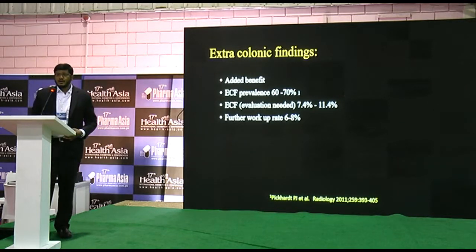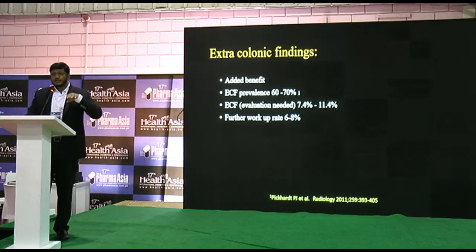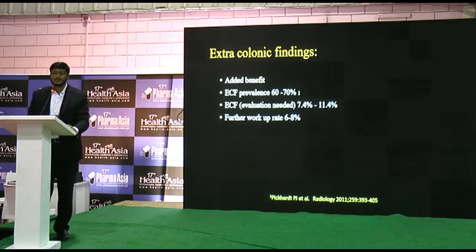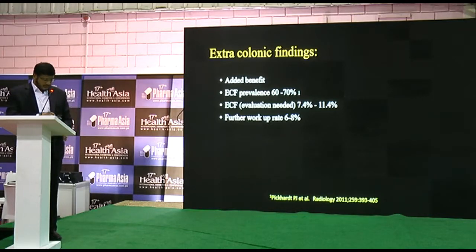Regarding the advantages of CTC, there is an additional benefit for the patient to see extracolonic findings. In optical colonoscopy, you are inside the large bowel and you cannot see outside the bowel lumen. So there is an additional benefit of seeing pathologies outside the lumen. The prevalence of extracolonic findings in the literature was found to be 60 to 70% of cases, in which there are significant findings we can see. Further evaluation for the significant findings has a rate of 7 to 11%, and further workup needed for that particular rate is 6 to 8%.